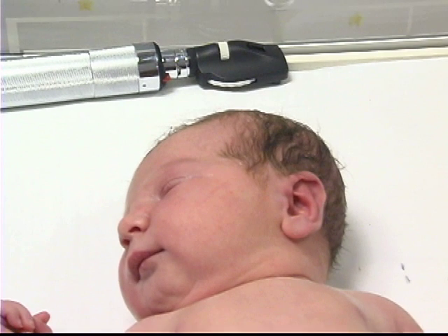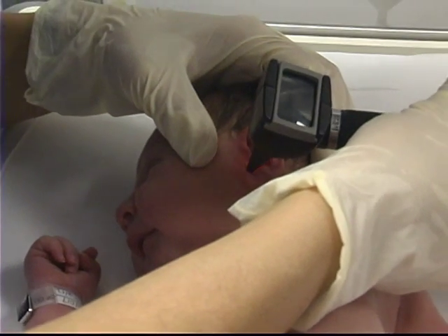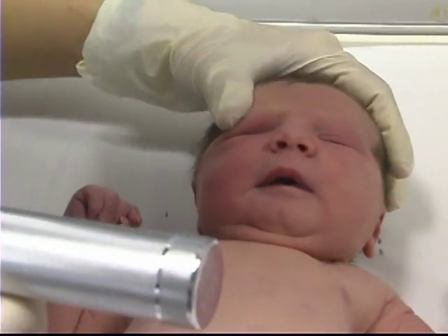Although an otoscopic exam is not routinely performed in the newborn period, this method can be used to assess patency of the ear canals. Stabilize the infant's head on the forehead with the heel of the non-dominant hand. Looking through the otoscope, inspect the canals.